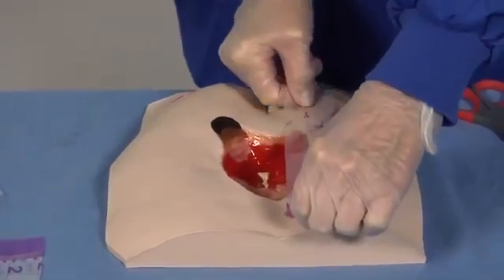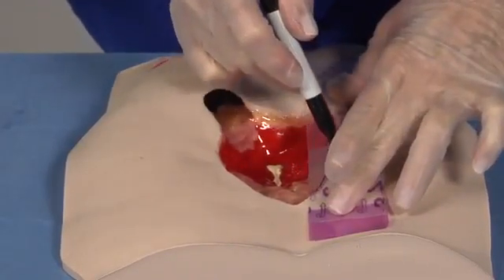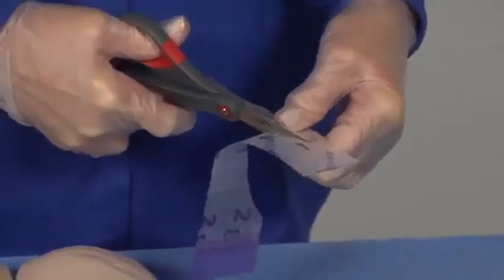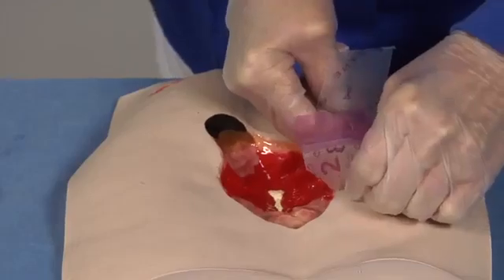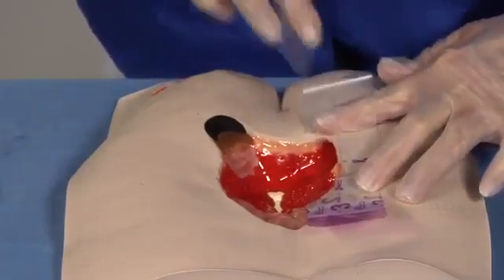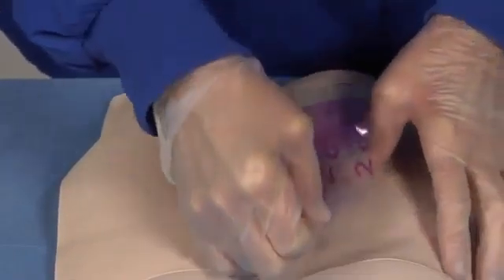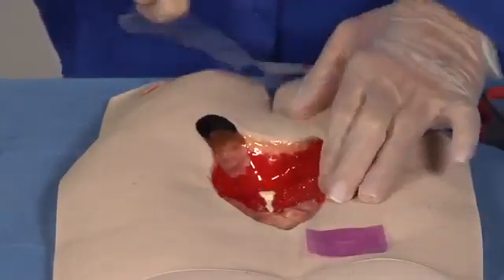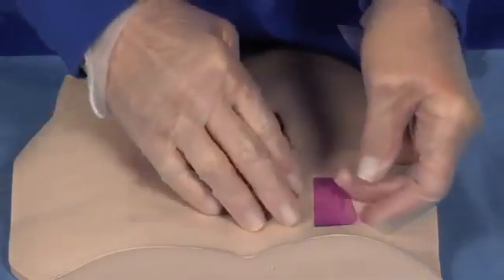To accomplish this, cut a strip of transparent adhesive dressing and place on the wound edge with the numbers 1 and 2 sides down. Trace the wound edge and trim adhesive dressing accordingly. After trimming, lay the dressing pieces down, taking care not to overlap the adhesive dressing strips, and remove the tabs. Repeat this process around the entire wound edge, leaving a 1 to 2 cm beyond the edge.